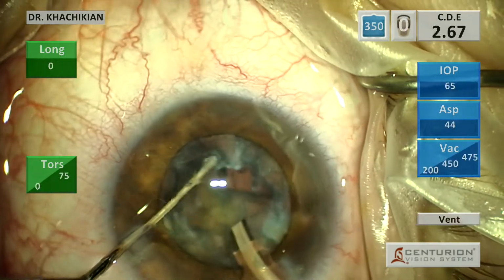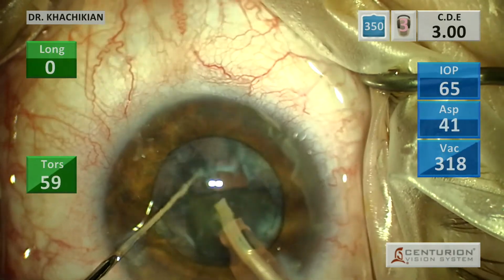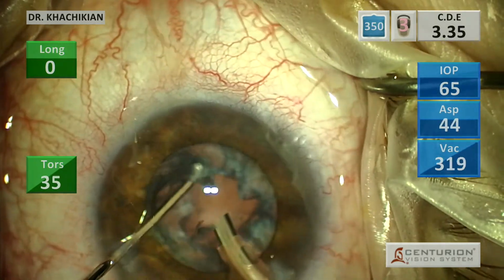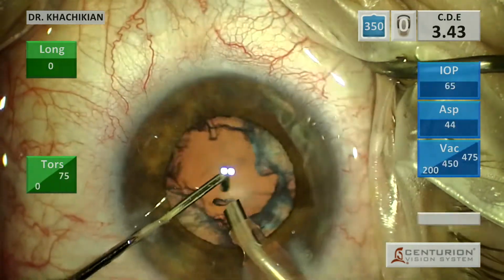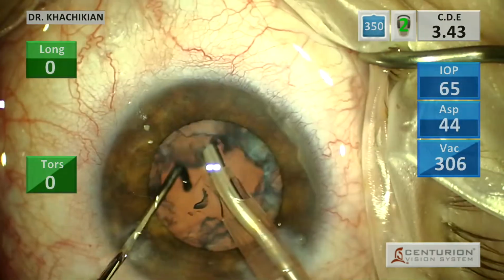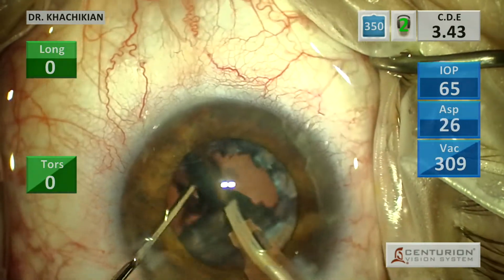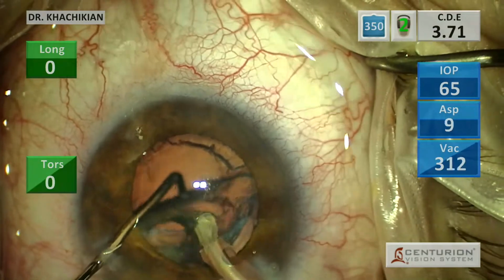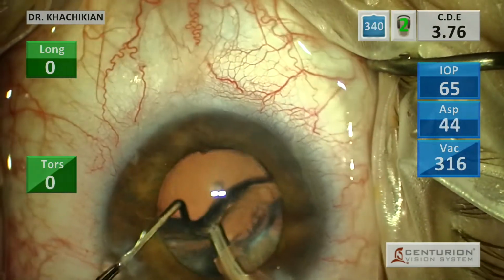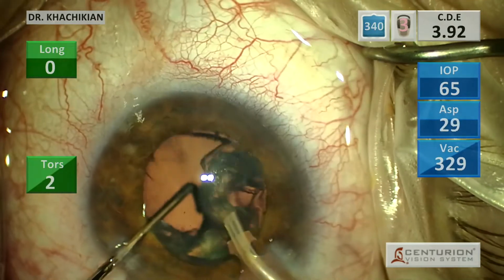We have removed all of our quadrants now. There's the last quadrant just coming out. Again, we try and keep that phaco handpiece almost in the bag. I don't really try and emulsify the lens in the anterior chamber. I try and emulsify it with the handpiece still in the bag, being careful with the second instrument to make sure that it's placed behind the lens to ensure that there's no trampolining of the capsule.